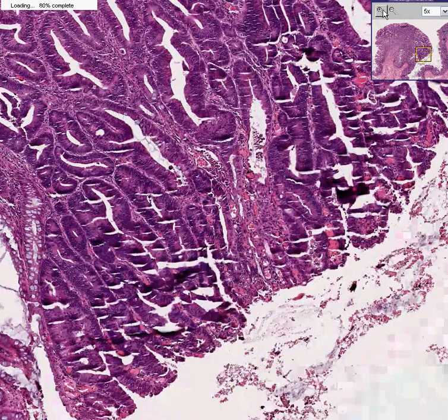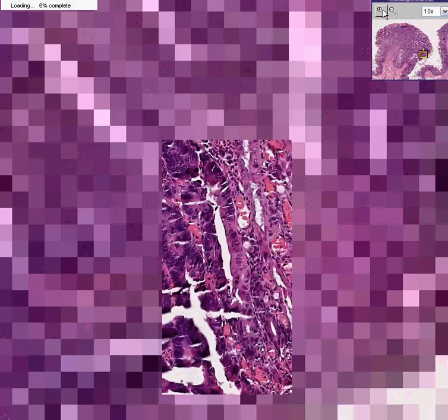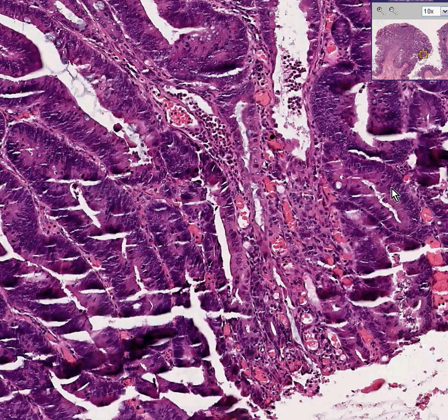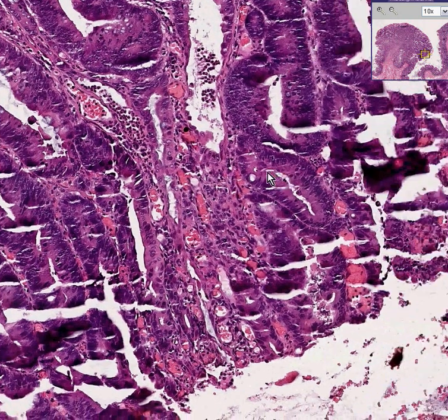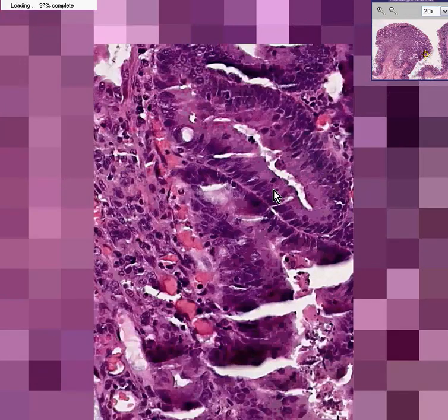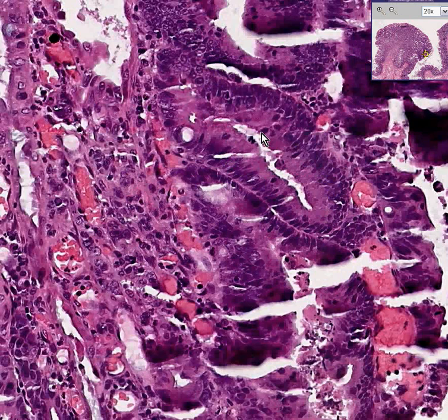do not have serration, because they are all darker, they do not have much orientation of their nuclei towards the base. They are atypical. They are occasionally darker and bigger and lumpier than they should be. And also, you can see here, and here, and here, are mitotic figures. This is an adenomatous polyp, and you can see considerable atypia here.